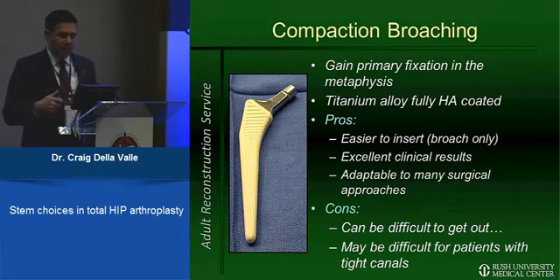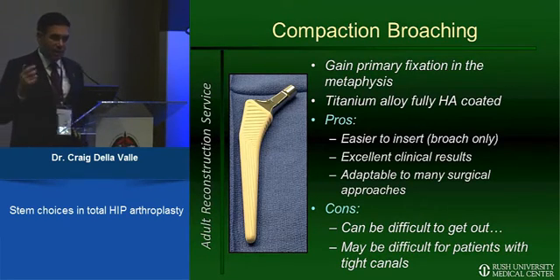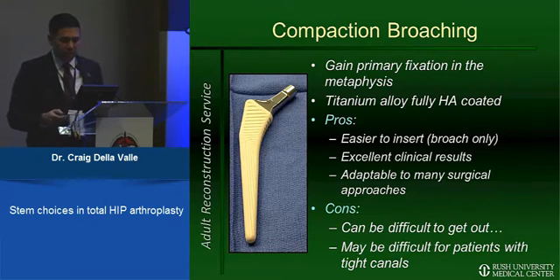I think the cons are that it can be difficult to get these out. Again, these are fully coated with hydroxyapatite, and if these osseointegrate fully, they are just about as hard to get out as an AML. It can also be difficult, again, in patients with tight canals if you don't ream them distally, so something to watch out for.